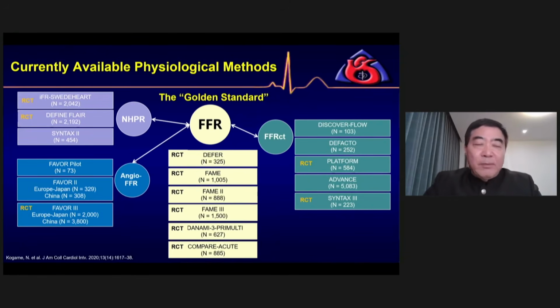Multiple randomized trials showed the benefit of FFR in guiding PCI versus conservative therapy, especially in intermediate lesions. Recently, dozens of FFR surrogates have been developed, such as QFR, which I think was developed in China, and iFR, CaFFR, CaIMR, RFR, etc. However, these FFRs are surrogates of myocardial ischemia that assess the luminal narrowing of the epicardial coronary vessel without any information on the microvasculature or microvascular dysfunction.